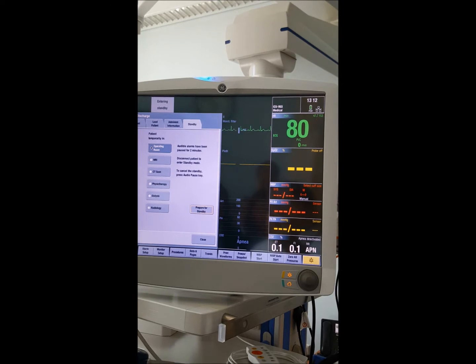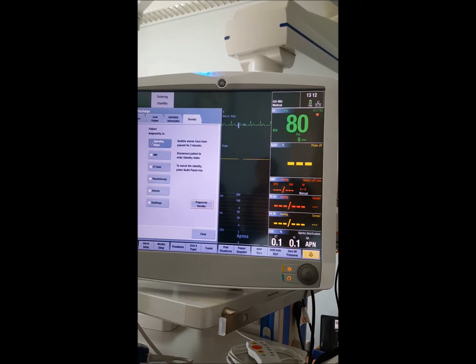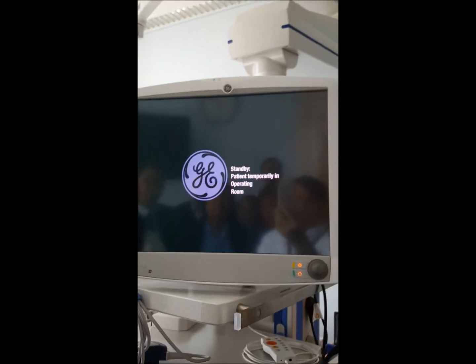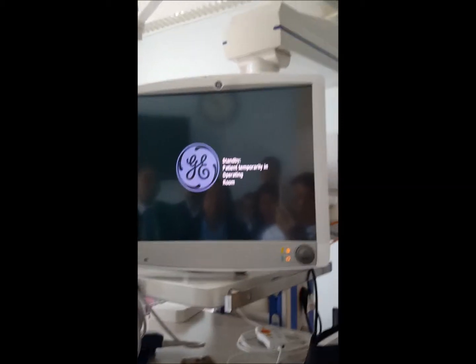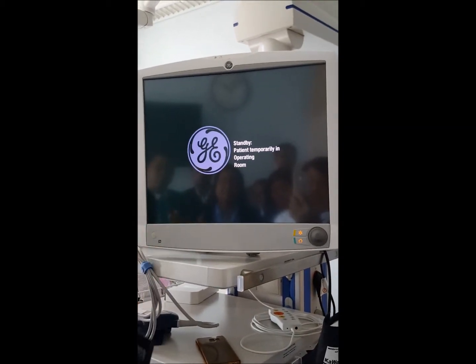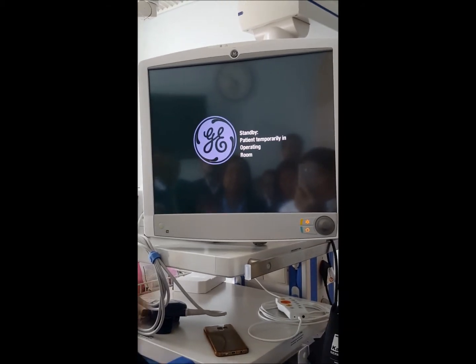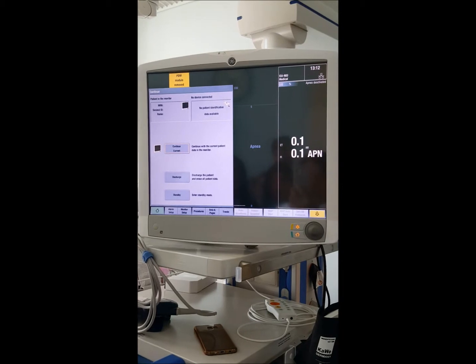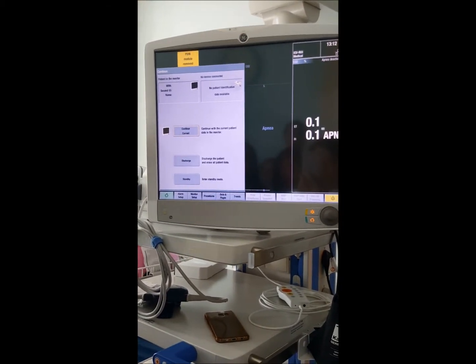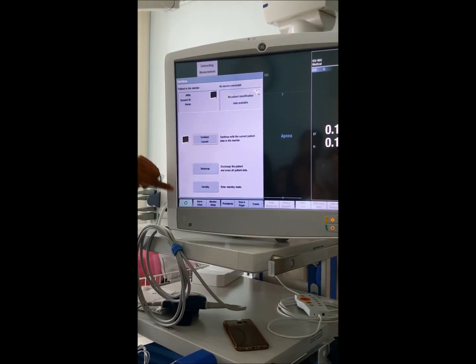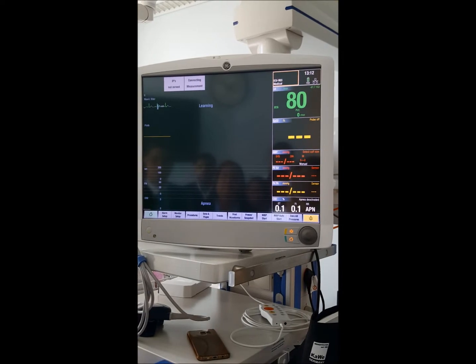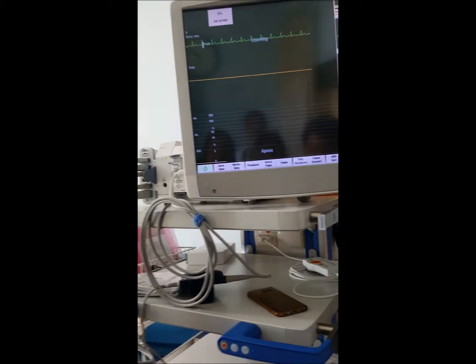The monitor enters standby with the patient location noted. When the patient returns, just touch the screen and everything comes back to normal. It will ask three questions: continue with current patient, discharge the patient, or standby. Select 'Continue with current patient' and all details from the time of admission are restored.